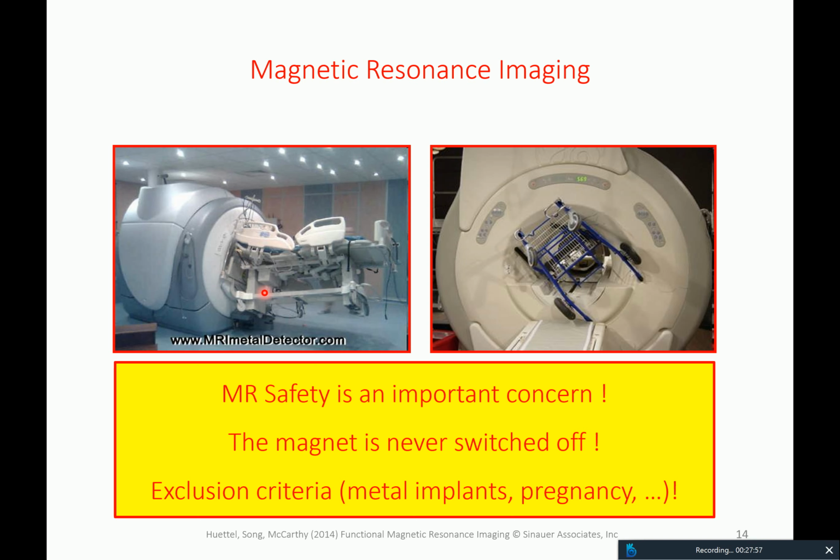This shows two examples of a hospital bed being drawn to the scanner because of the magnetic field, and here a medical device. Hence, you really need to be on your toes and be careful when you use magnetic resonance recording for your research.